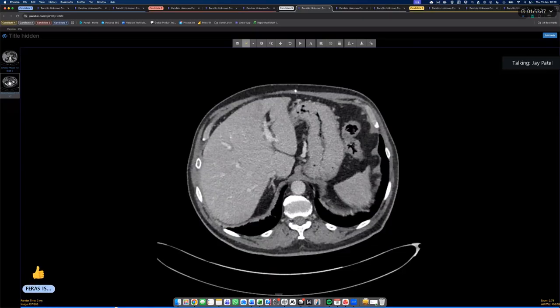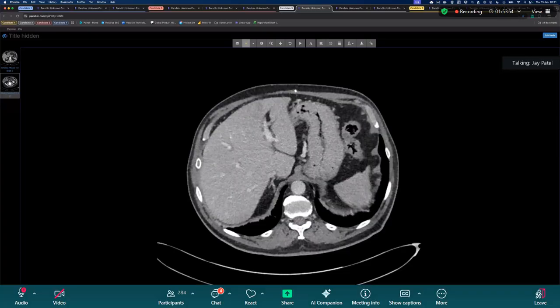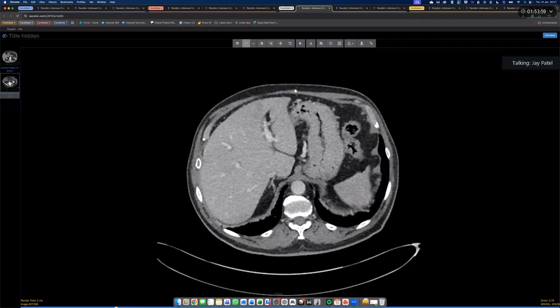Again, just from an educational perspective, if you are concerned, what could you be concerned about if this was diffuse gastric thickening? What's the word? So the patient would be having definitely some symptoms. The pattern is more in favor of linitis. Good. So linitis plastica is what you're raising a concern of. Now, as an educational point, endoscopically, linitis plastica is actually quite difficult to diagnose. You put the endoscope down, the gastric mucosa looks pretty normal.